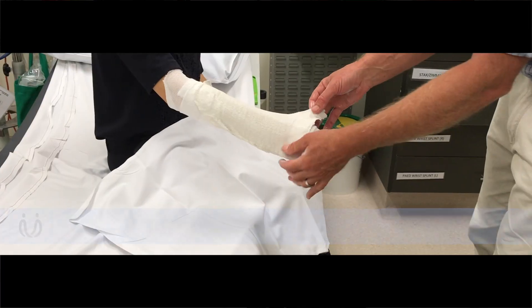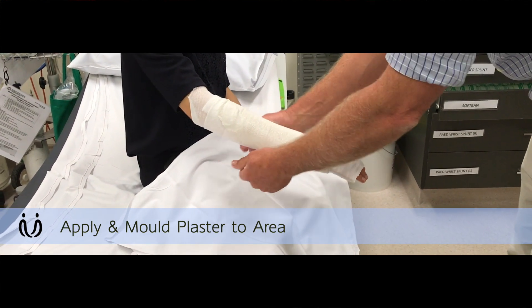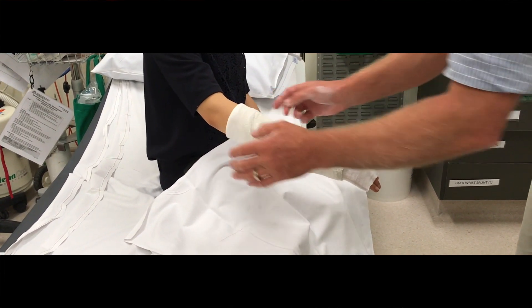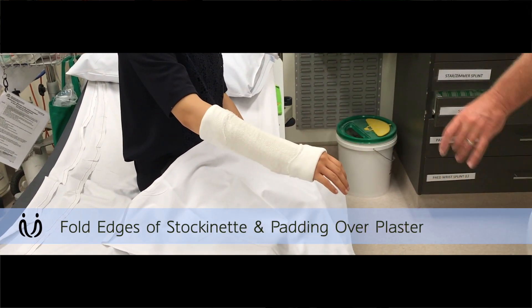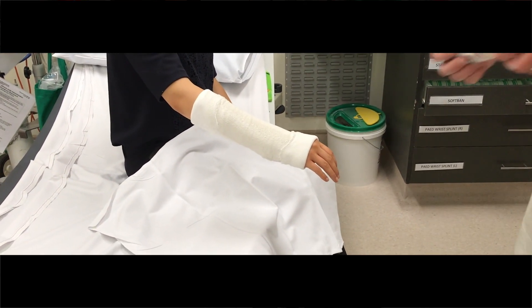Then you can put it to the knuckles, and that goes around your thumb there, and that's down. Once you've got that on, you want to get each end and fold it around so you've got a nice smooth edge — it's not going to dig in. And similarly with your fingers you've got a nice smooth edge. And then the final bit is just putting on a tape bandage.